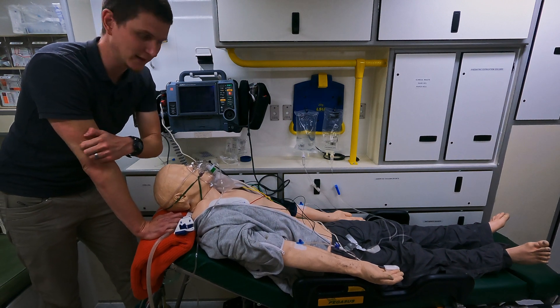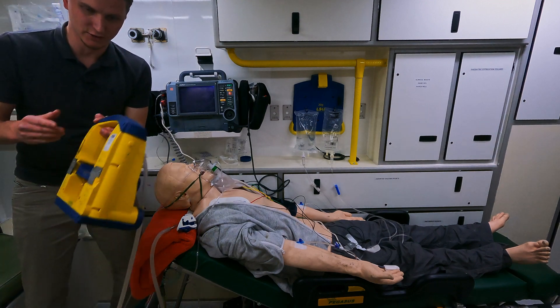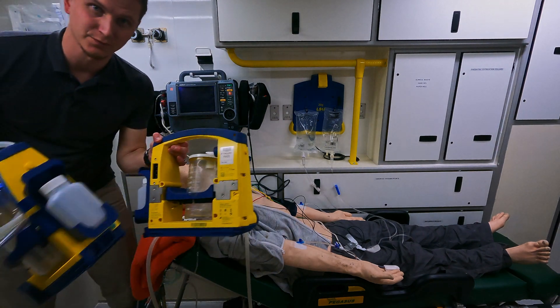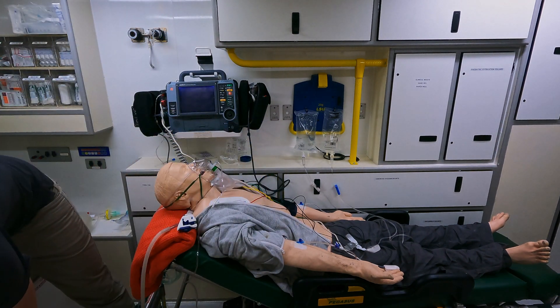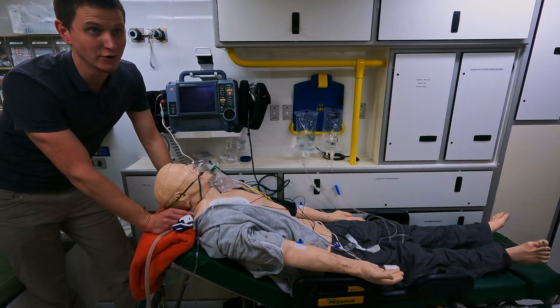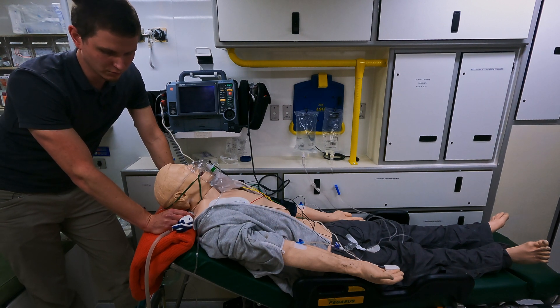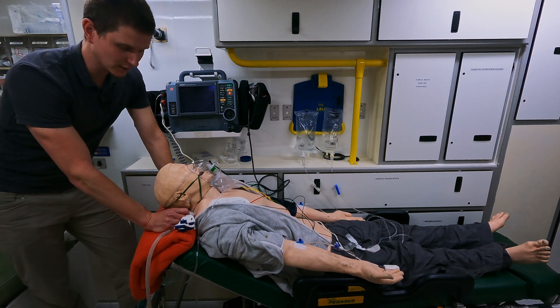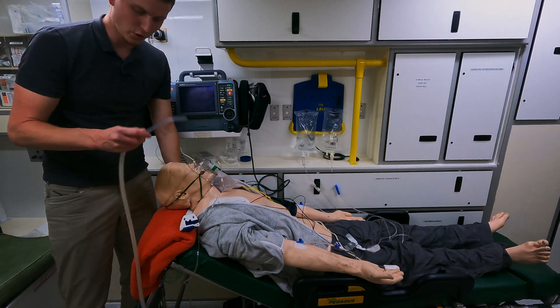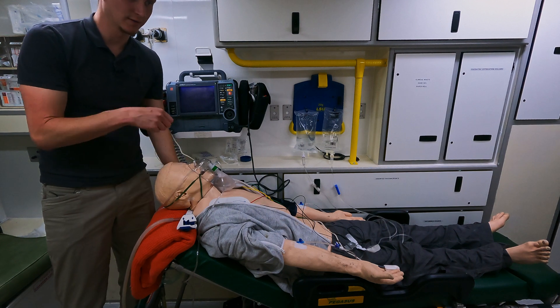The first S is suction. They don't just mean one suction — they mean two suctions. Why two? Because when one gets full it stops working and then you don't have suction. So it's really important to have two functioning suctions, with the suction catheter working and positioned under the right shoulder — because that's the hand that uses the suction.